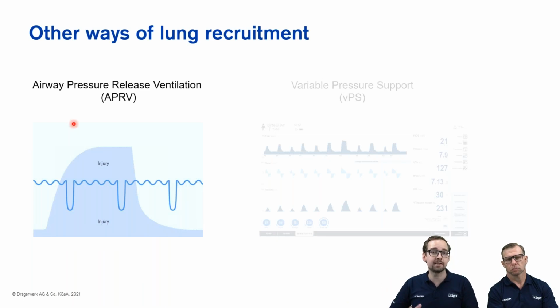One last topic, at least I think we want to mention this, is of course to use airway pressure release ventilation. This is a completely different philosophy of ventilation, especially when we look at and focus on the publications by Nader Habashi. So when we talk about airway pressure release ventilation, you see actually down here in this graph really already the main philosophy. We are trying to increase the mean airway pressure.